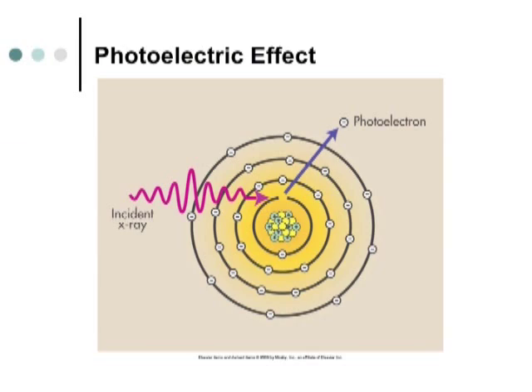And really, if you set the proper kVp, it's a random event where the photon will hit, whether it hits an outer shell and produces a scattered photon, whether it goes straight through the patient and ends up on the film, or whether it hits the inner shell and is absorbed. But for the most part, we are air. If you look at an atom and the nucleus was the size of a baseball, that K shell is a whole mile away. Okay? So the majority of the X-ray will pass through us. But the thicker the part is, the more interaction you're going to have, the more absorption you're going to have.